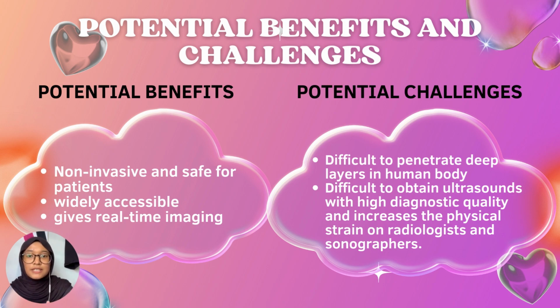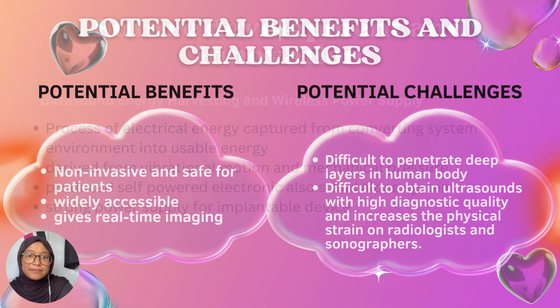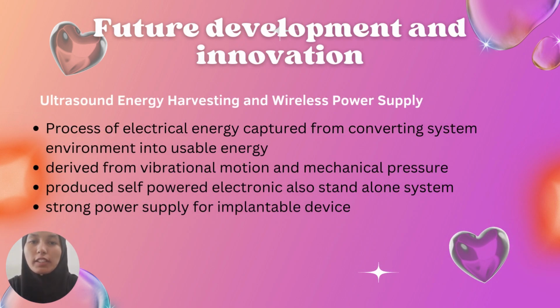Regarding some tissues and structures, ultrasound might offer a different level of detail than CT or MRI imaging. So, if the low frequency probe malfunctions, the radiologist must use a dose-producing CT scan or a more costly and time-consuming MRI exam. The next slide is about the future development and innovation.